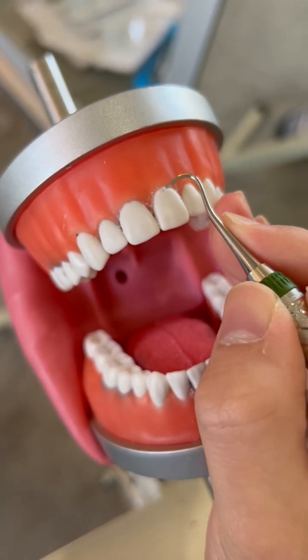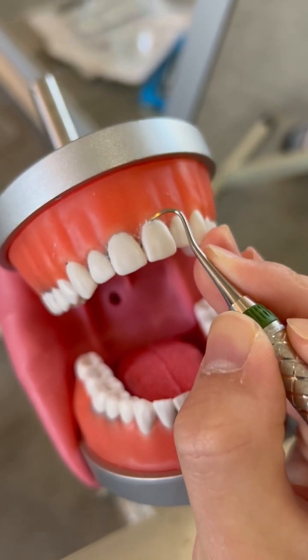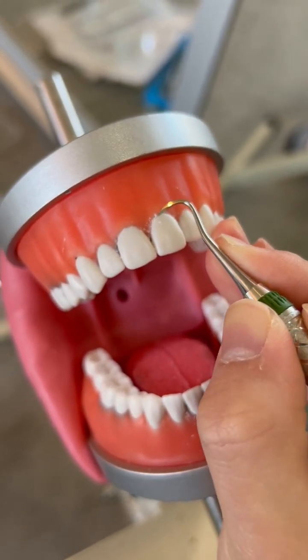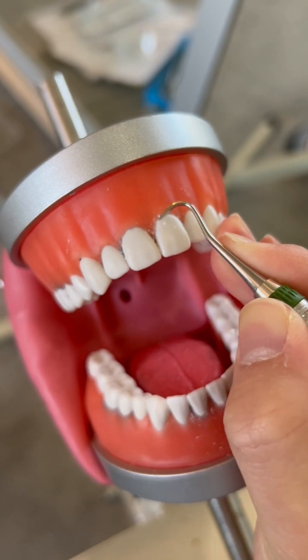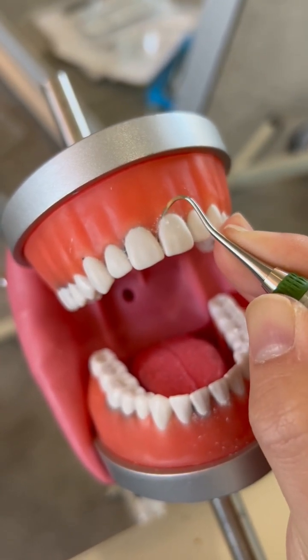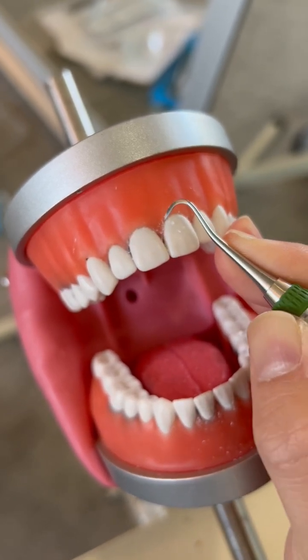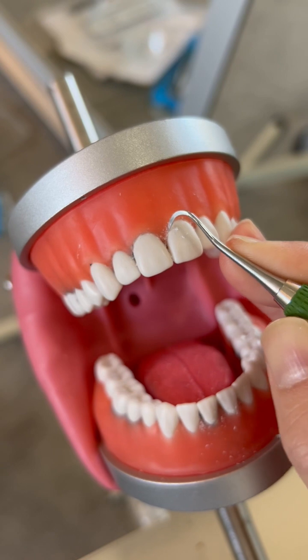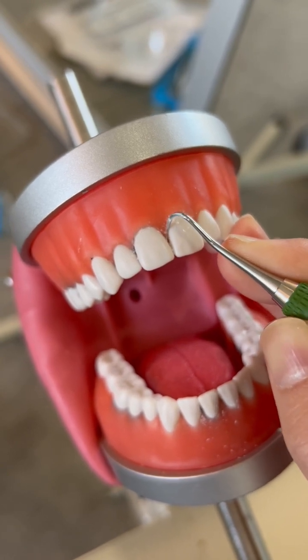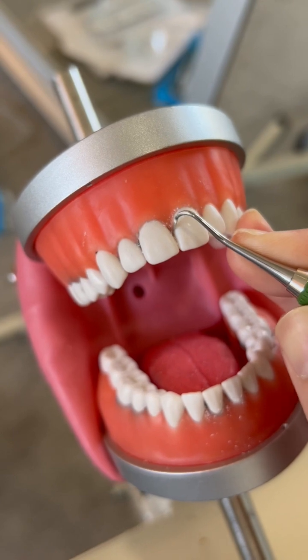Same way to number 9. Start at the midline, side to side, pivot and roll, side to side, pivot and roll. Only go half of the interproximal space.